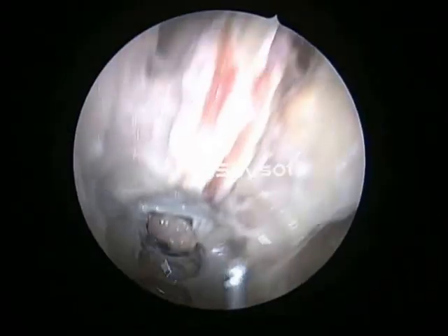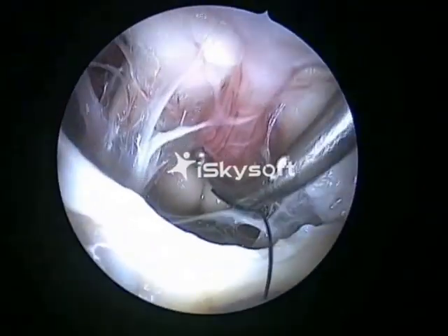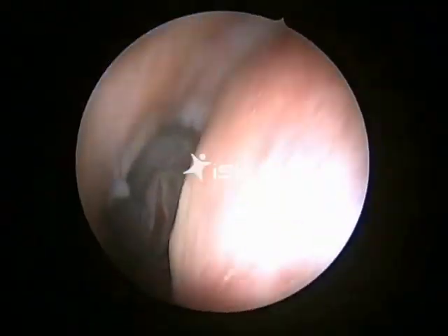We are now using a 70-degree telescope to perforate the tuber cinereum. Once that is done, we can have a look at the third ventricle.